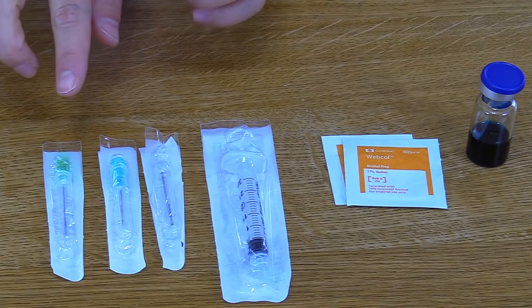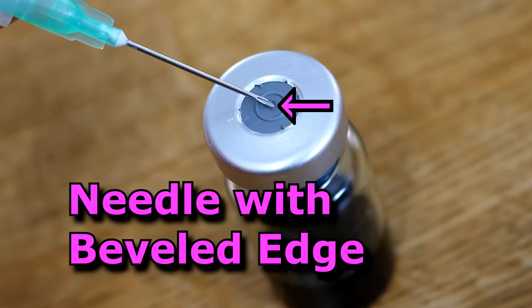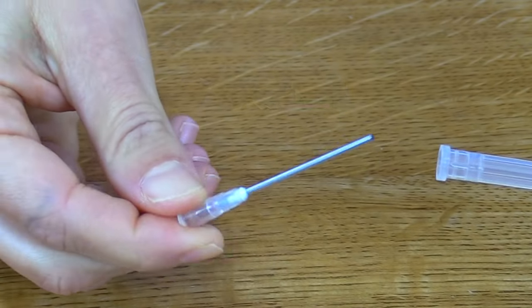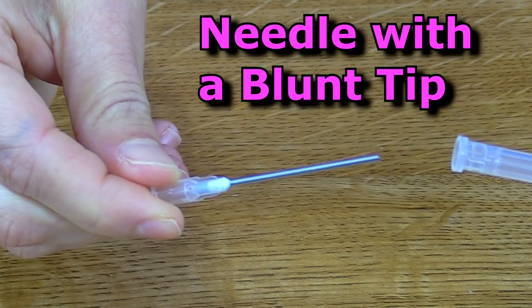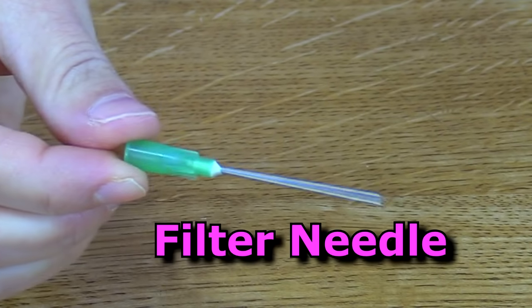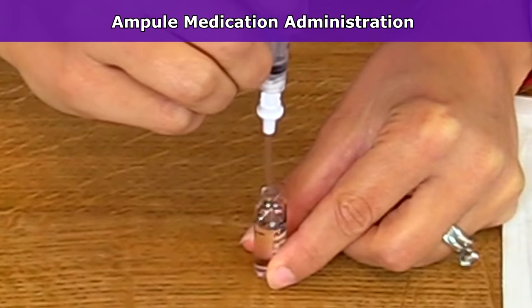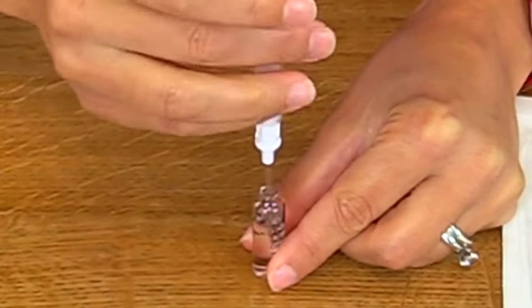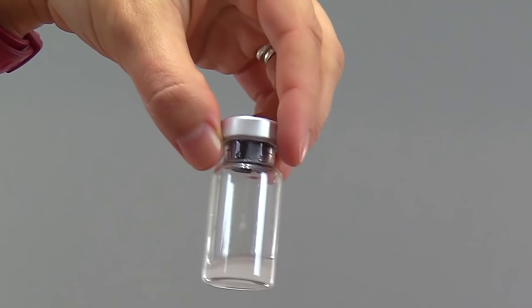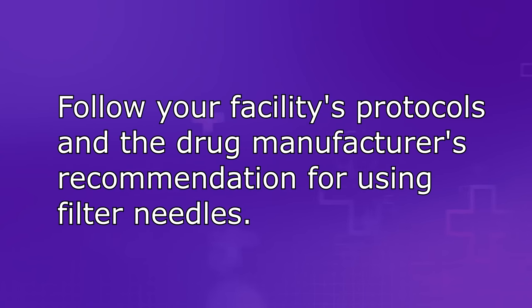You can use different vial access devices to withdraw the medication from the vial. One type is just a plain needle with a beveled tip. Another type is a blunt tip fill needle, which can be used to decrease needle sticks during medication prep, or a filter needle can be used. Whenever you're withdrawing medication from a glass ampoule, you'll always want to use a filter straw. Some medications reconstituted from powder form may also need a filter needle — check your facility's protocols and the drug manufacturer's guidelines.